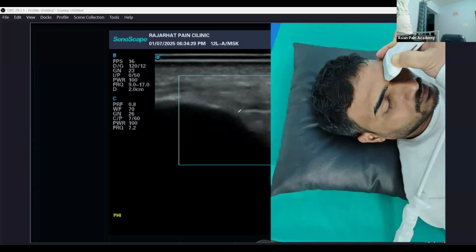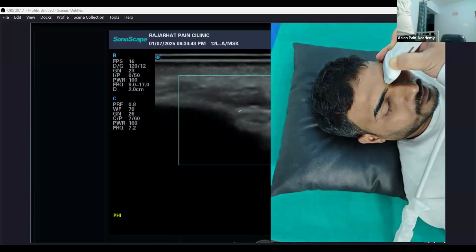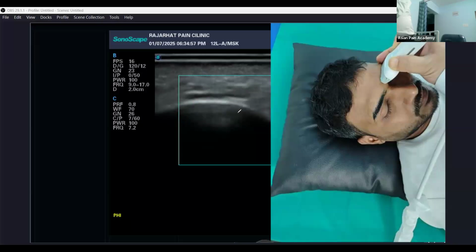Okay. So this is a neurovascular bundle. We can see the vessels; the nerve is hardly seen. When we put it for block, of course, you can give local anesthetic directly. And if you want to do radiofrequency, then put the radiofrequency needle, and with sensory stimulation, you can locate the nerve. But this is the location of the supraorbital foramen.